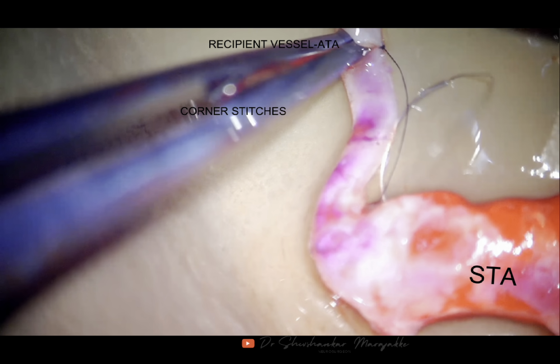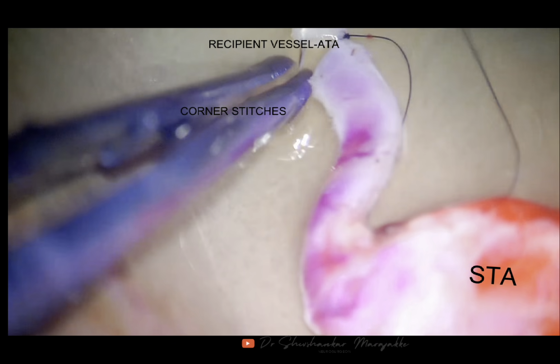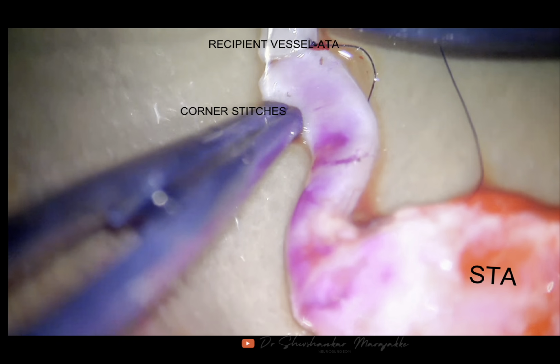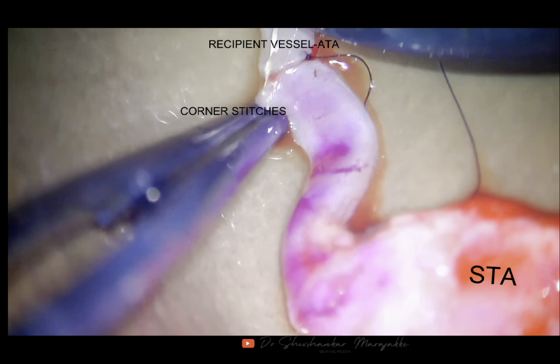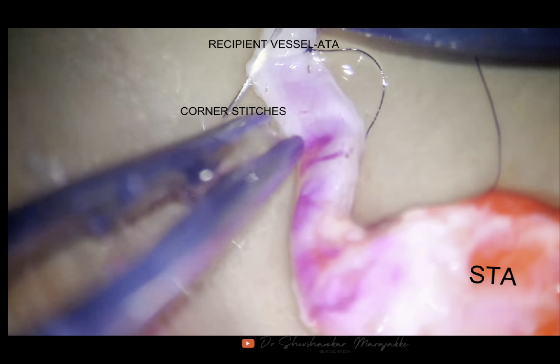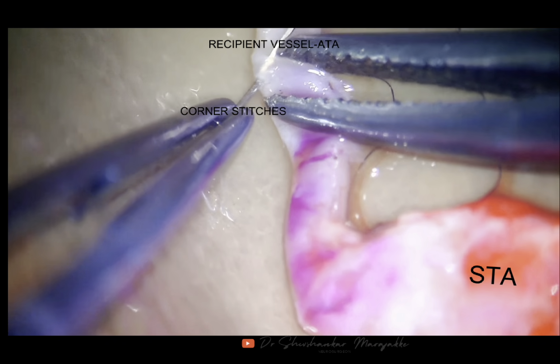So the end-to-end anastomosis is successful only if all the pathology is excised, like the atherosclerotic plaque we excised in the beginning. Because if something remains, it comes into the suture line and that damages the anastomosis.